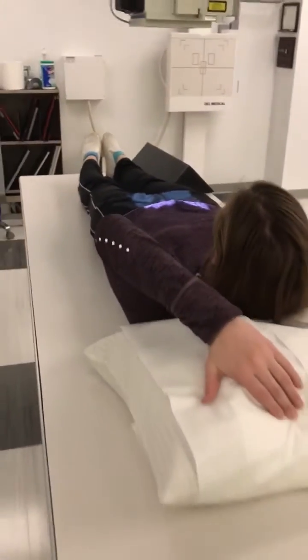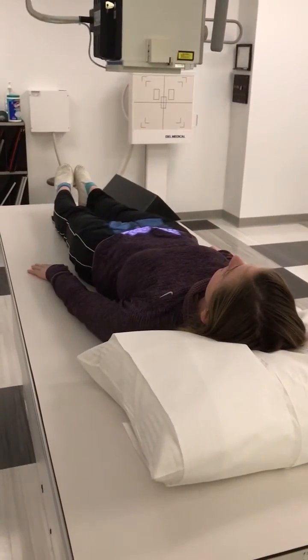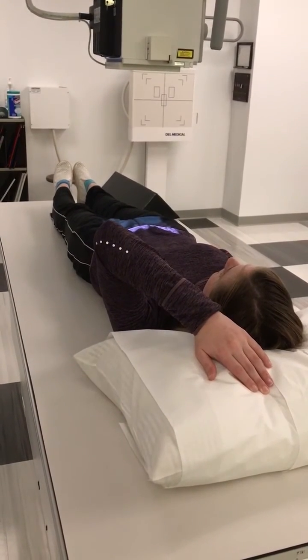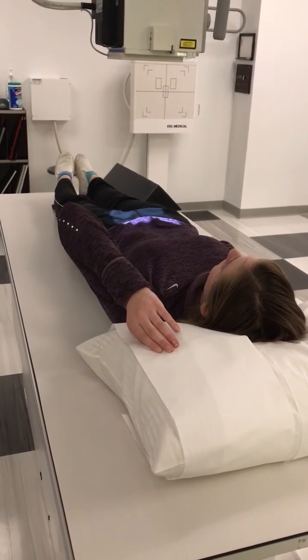And this is your post void. So this means this image is taken after you let your patient up from the table, they've used the restroom, and then they come back. Taking a deep breath, blow it all the way out, hold it, exposure, and we breathe.